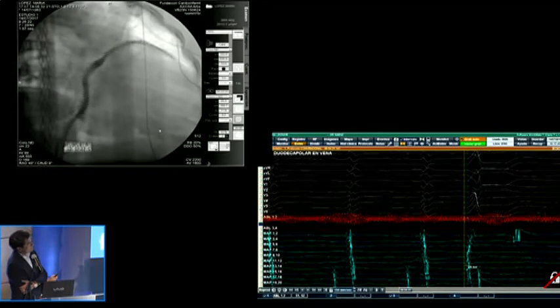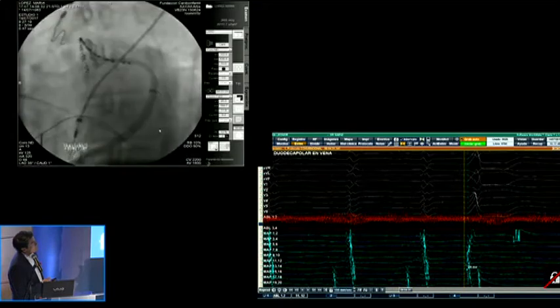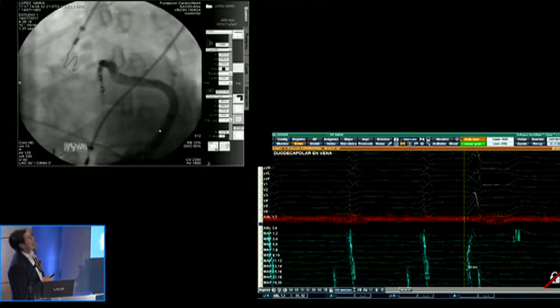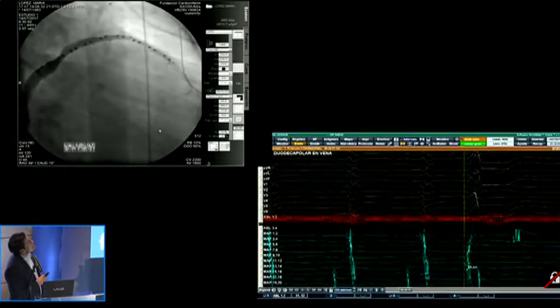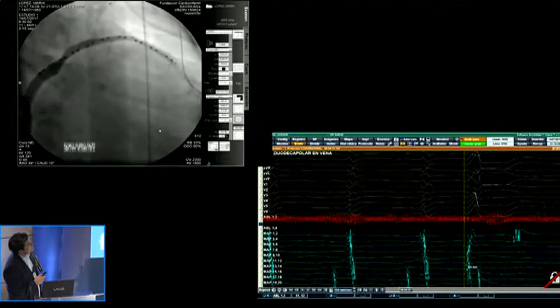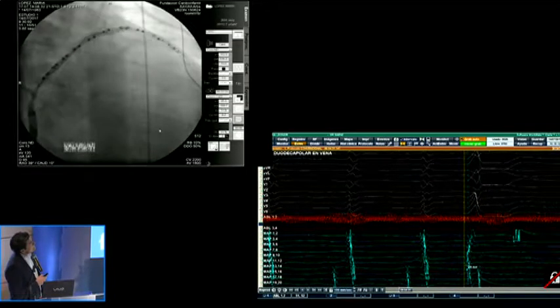And in the venogram, you can see how we can map the perforating veins. What's important in order to understand the perforating veins is that you have to adjust the fluoroscopic projection in order to see them. Show me the right oblique with caudal angle. This is the right oblique with a caudal angle that separates. No, we place a Lima catheter, 4 French, Terumo. And here we are doing the injection.